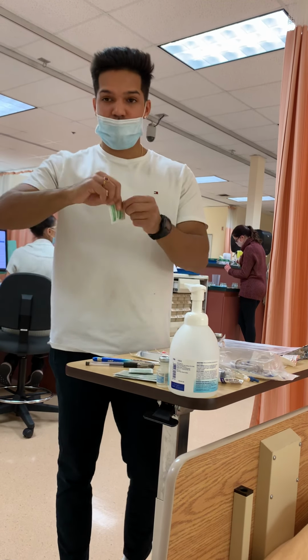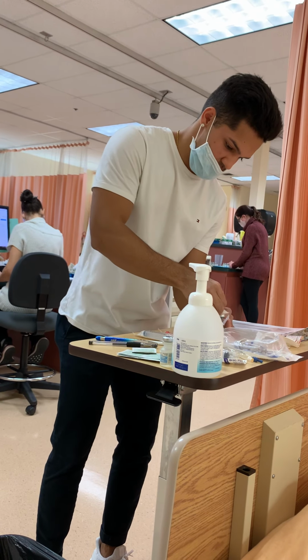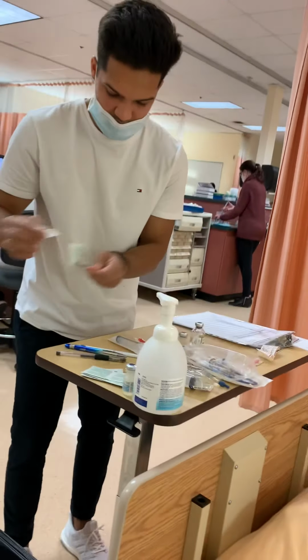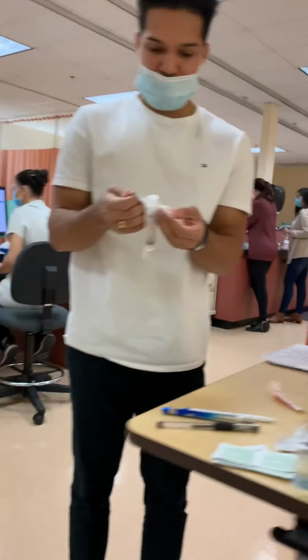The first thing we're doing is wiping the top of my vials for 30 seconds, letting them dry for 15. Once I've done that, I'll just let them dry.